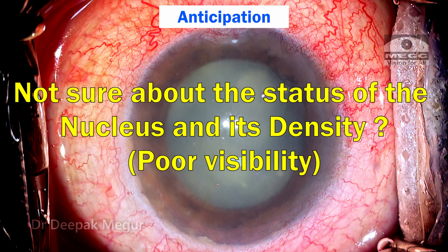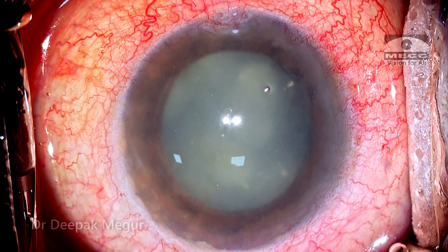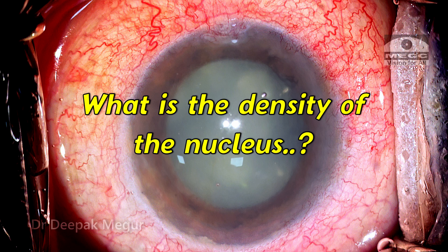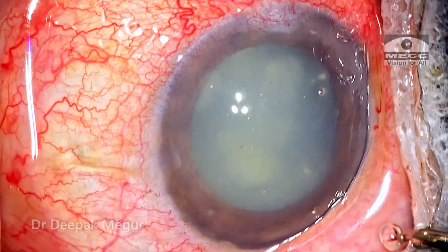I'm not sure about the status of the nucleus and its density because the visibility is so bad. It looks like the anterior chamber is filled with lens particles. I'll get a sense of how the capsule and zonules are, and the density of the nucleus, only once I enter the eye. As the side ports are being made, these are the things running through my head.